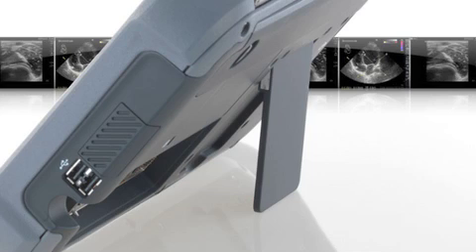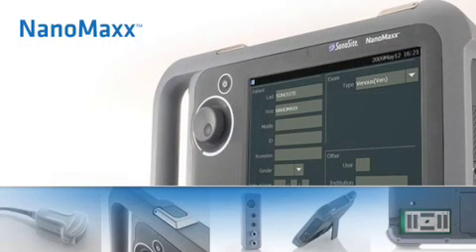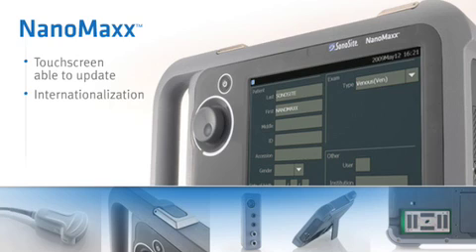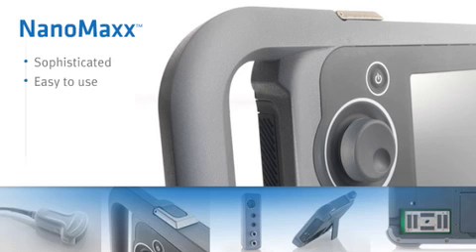Getting your images to your PC couldn't be easier with the ability to transfer via USB. By implementing a touchscreen in the NanoMax design, the interface can be updated for efficiency improvements and internationalization through software updates. Its sophistication and ease of use, combined with superb image quality, make the NanoMax meet the needs of our customers.